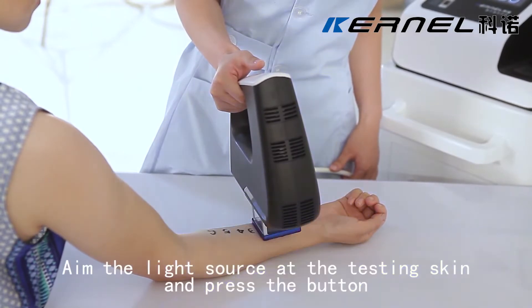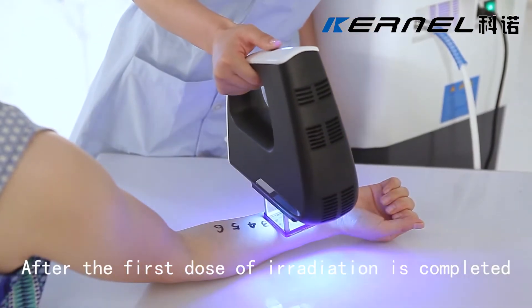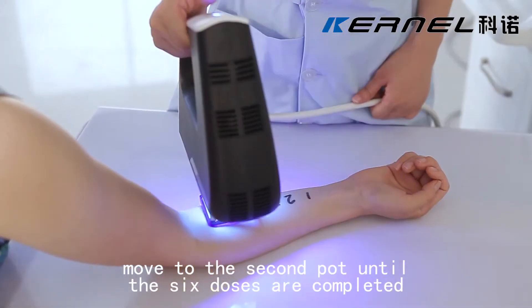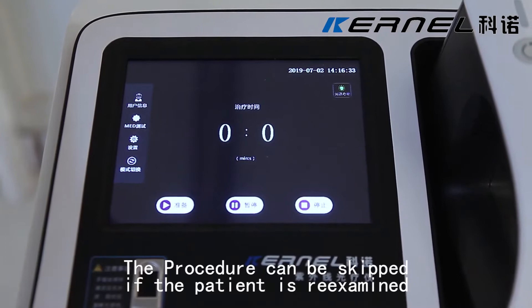Aim the light source at the testing skin and press the button. After the first dose of irradiation is completed, move to the second spot until the six doses are completed. Press the back button to return to the main interface. The procedure can be skipped if the patient is re-examined.